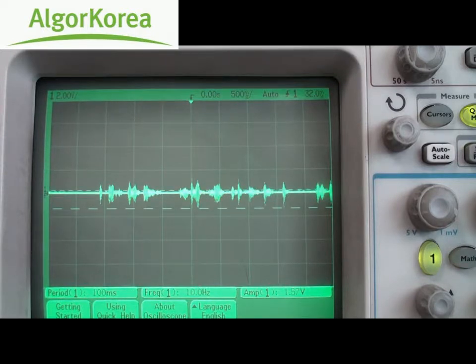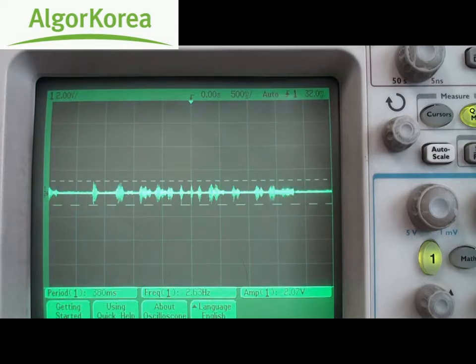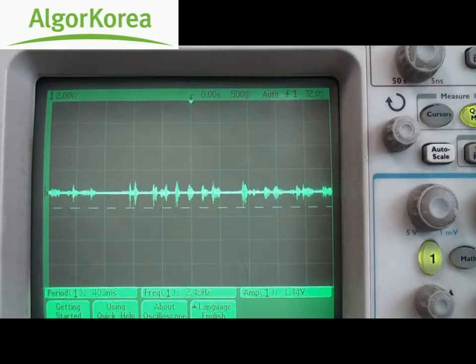where the output is just a pass-through, where the input comes in and then it goes out. The microphone on the hearing aid picks up the sound, it passes through the hearing aid where it's amplified, and the output is sent out through the receiver without any noise reduction. So let's see the effect of case 1.